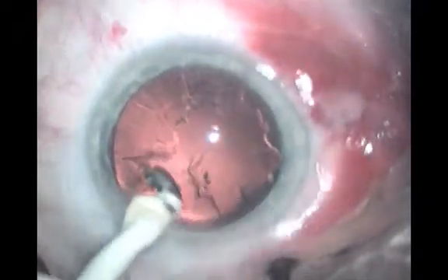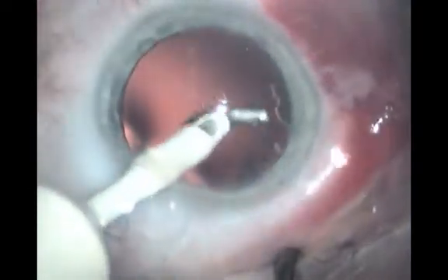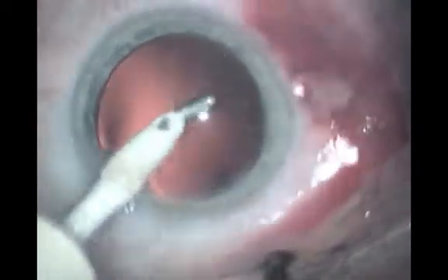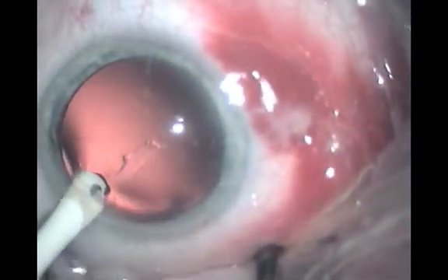If the pupil is large and there's a good, clear view, removal of cortex is seldom a problem. The removal of cortex should be a relatively quick procedure done at a safe speed commensurate with experience.